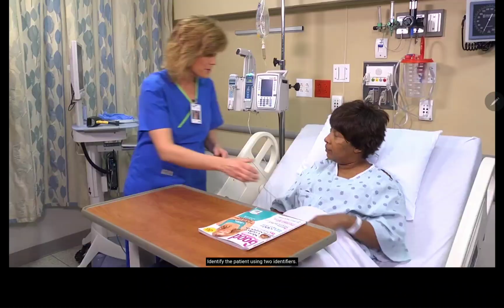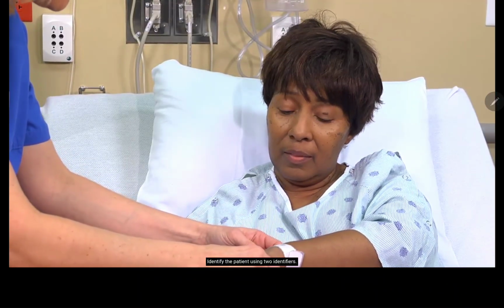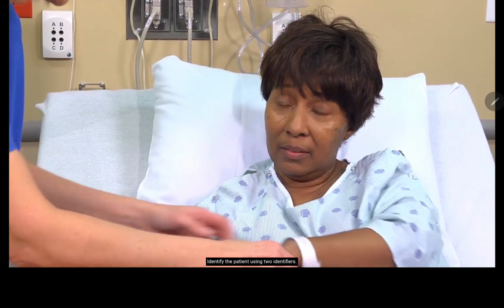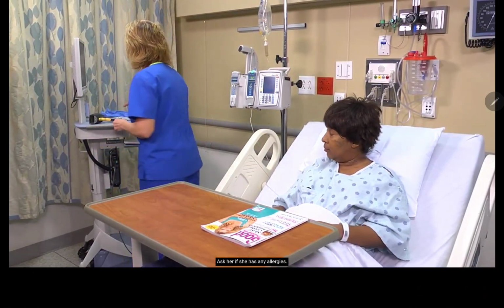All right. If you wouldn't mind just stating your name for me, please. Sylvia Cruz. Okay, and your birthday. 12/30/55. Okay, Sylvia, do you have any allergies? No. Ask her if she has any allergies.